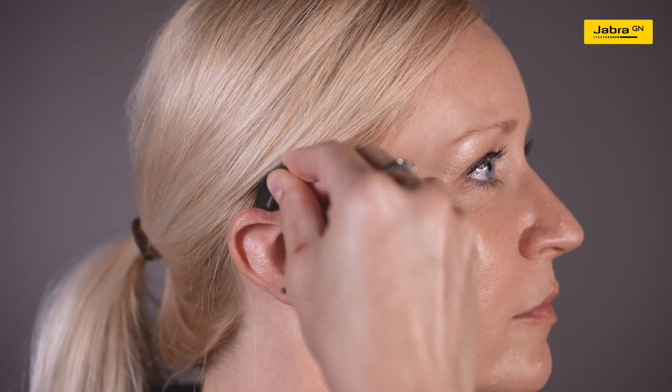Identify your right and left hearing aids using the color indicators. For the right ear, select the device with the red color indicator.